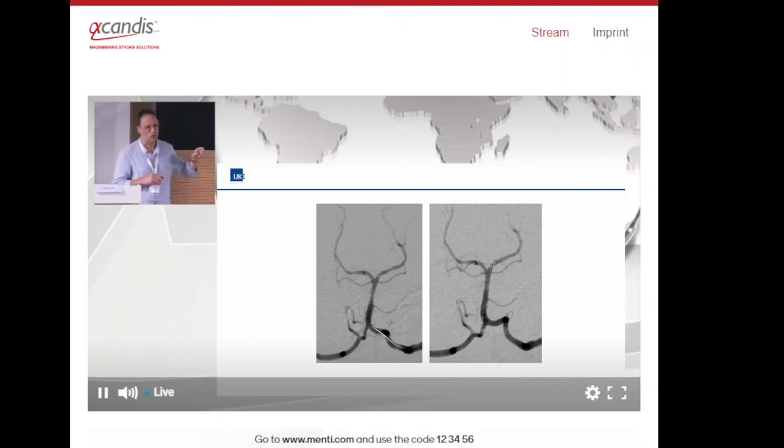And you all remember this was the first Solitaire that you could actually detach, something that was quite handy in some instances. And the patient, so he had a large infarction at the beginning, but in the end after rehab he was fine.